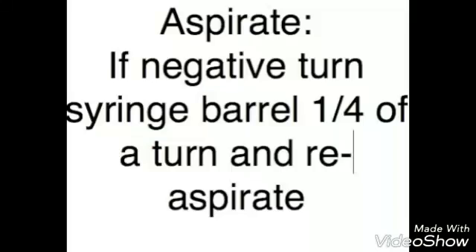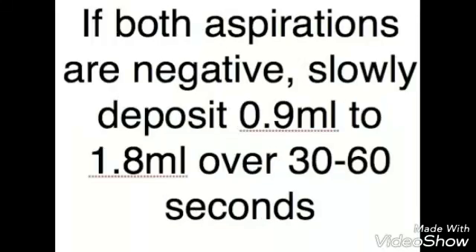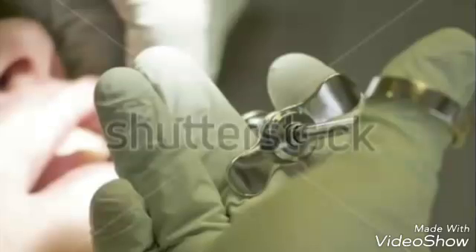Aspirate on two planes. If negative, turn syringe barrel one-fourth of a turn and re-aspirate. If both aspirations are negative, slowly deposit 0.9 to 1.8 milliliters over 30 to 60 seconds.